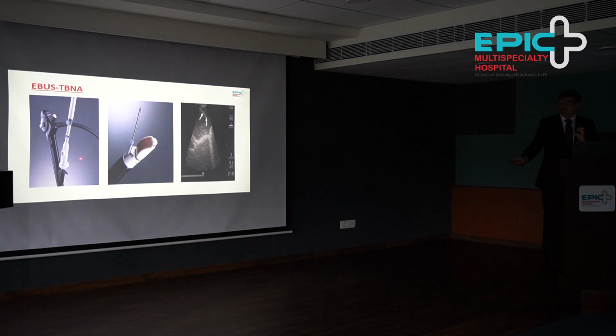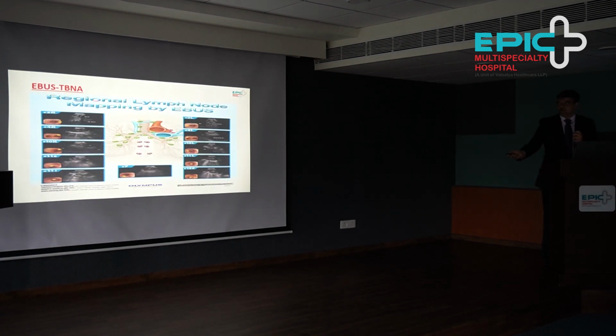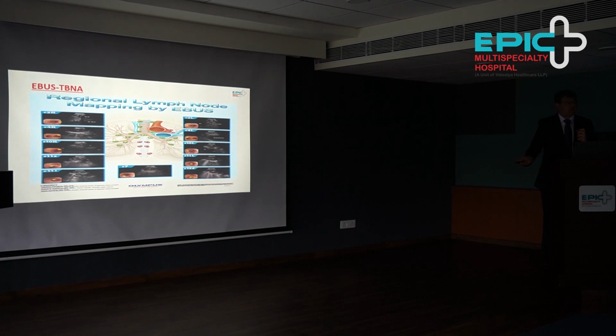There is a dedicated needle called EBUS needles. There are many varieties of these needles, and each has its own pros and cons, which is beyond the scope of this lecture. So here you can see this is the working channel from which the needle passes, the needle comes out, and it punctures the lymph node, and we get the sample. This is a good regional map which shows where we have to puncture in different stations.